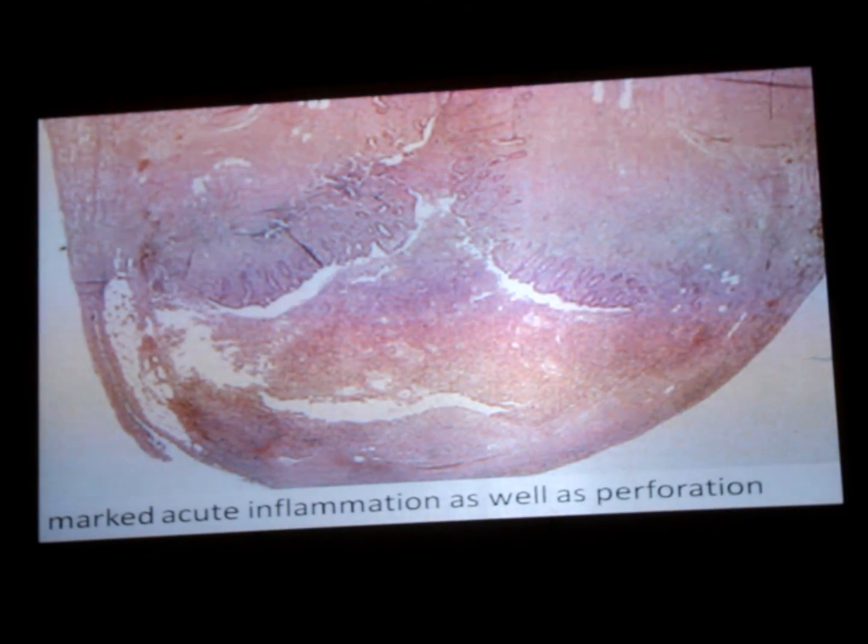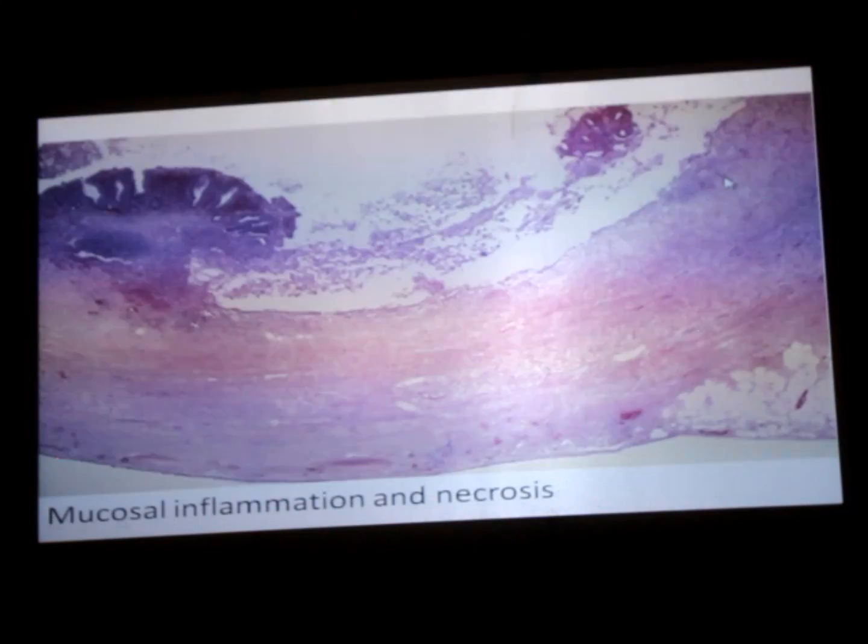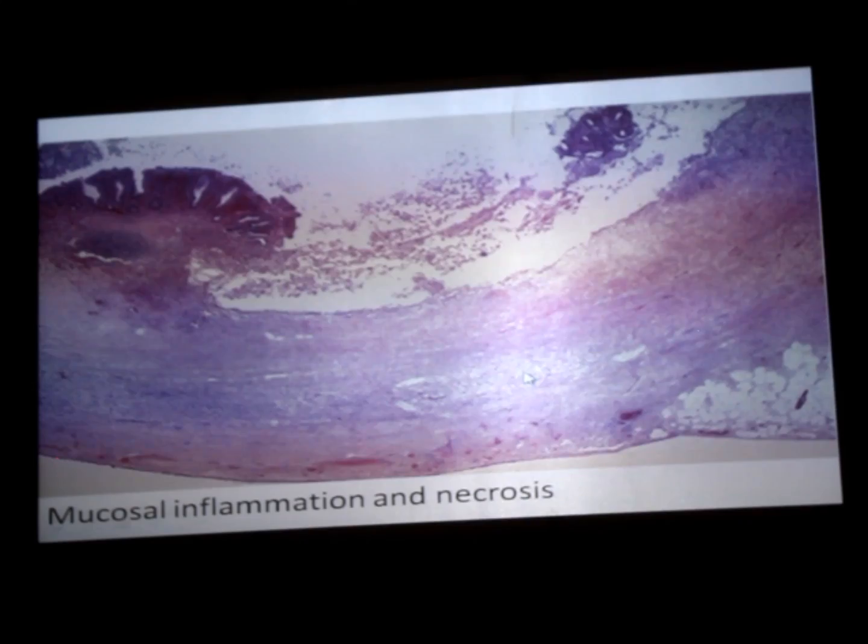Okay. So you should see presence of neutrophils inside the 3rd layer, muscle layer, to say it is acute appendicitis. Sometimes what happens, due to other causes, some inflammatory cells from the lumen may go up to mucosa, submucosa here. But it will not go to the muscularis propria, the muscle layer. So that will not be acute appendicitis. To say acute appendicitis, neutrophils should be present in the 3rd layer, or sometimes in the 4th layer. But if they go from here till the 3rd layer, it is acute appendicitis, muscularis propria.